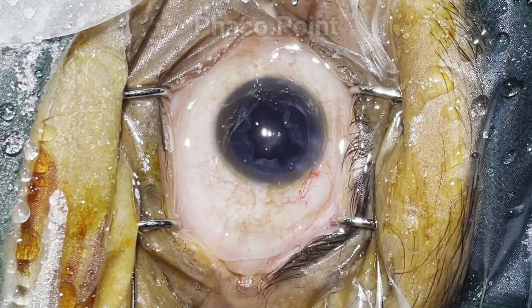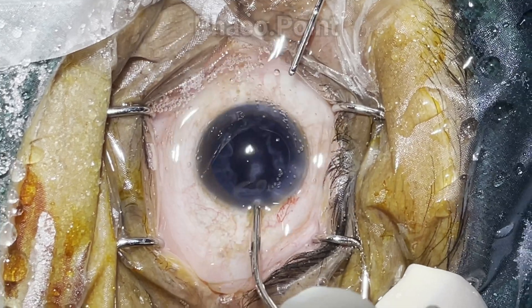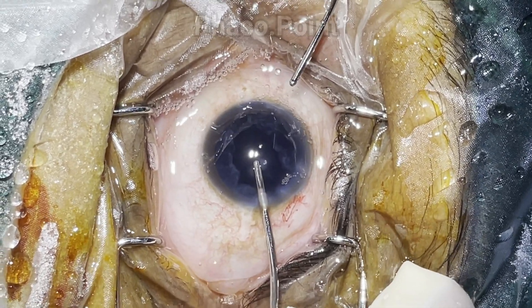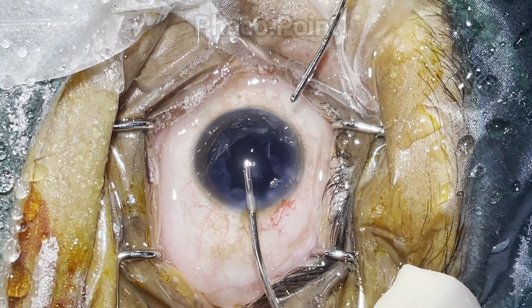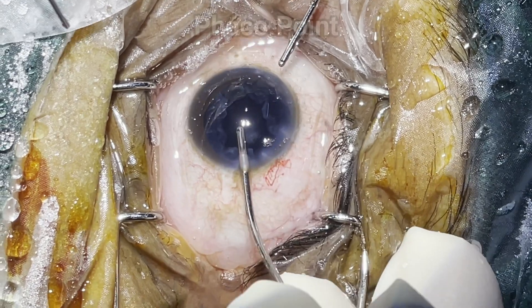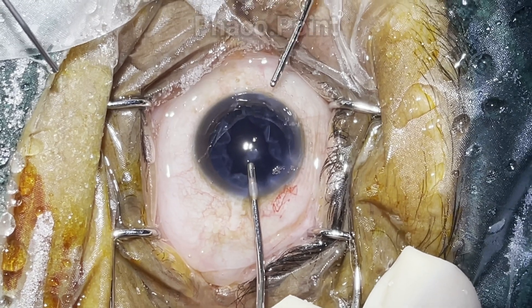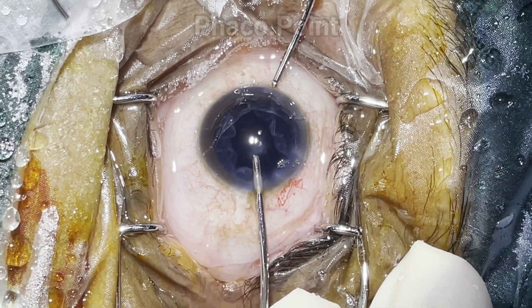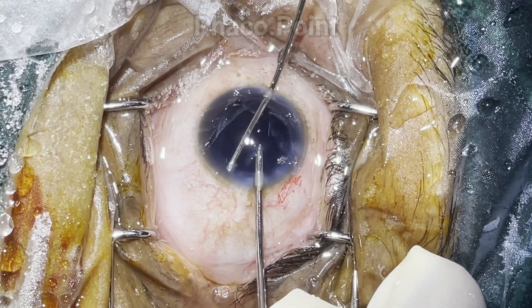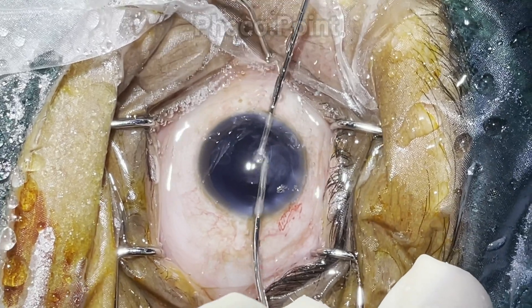Being a left-handed surgeon, during irrigation aspiration at the outset the irrigation is held with my dominant left hand. As you can see, the aspiration ports are held such that they face the angle as opposed to facing the endothelium, which would cause damage to the endothelium. With the irrigation held in my dominant left hand, my non-dominant right hand works at removal of the cortex diametrically opposite to it.